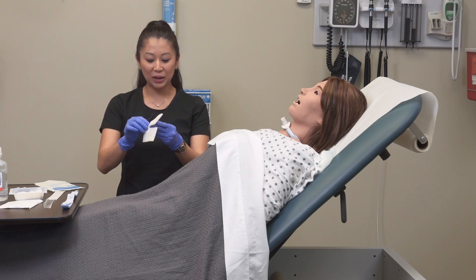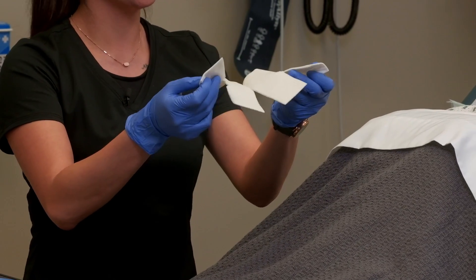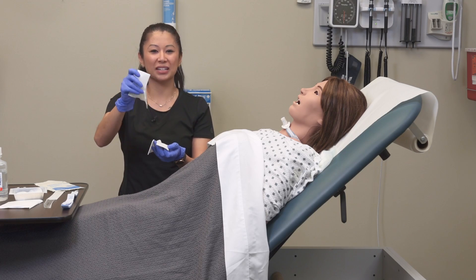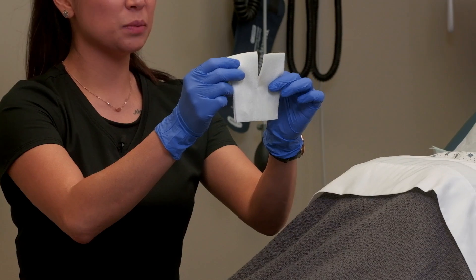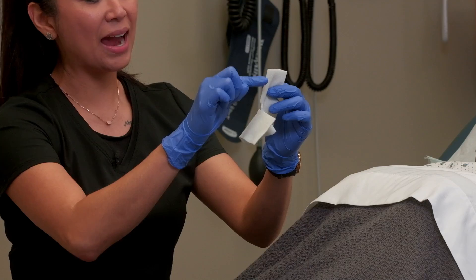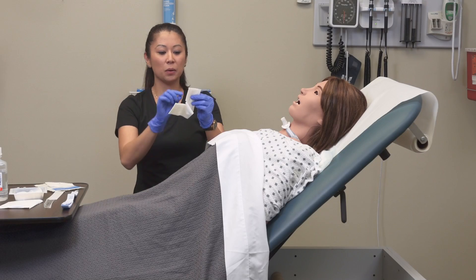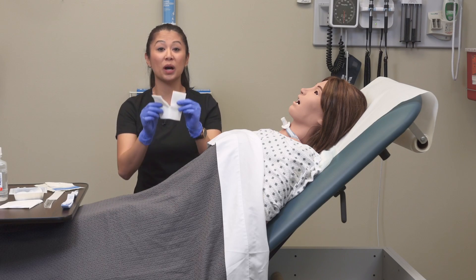When you open this up, you'll notice there are two split sponges — just assess your patient, as some tracheostomies are extra gooey and you may need both. For this demonstration I'm just going to use one split sponge. Notice how this split sponge is already pre-split for you. Also notice how clean and neat the edges are — this is important because if I'm going around the airway, I'm not worried about little filaments or loose material getting down the patient's airway. This is why we use this specific dressing.